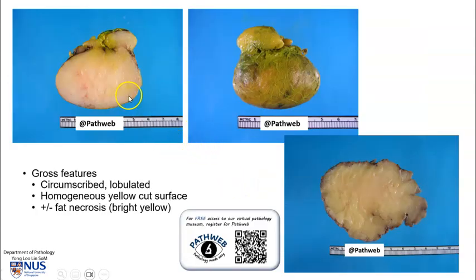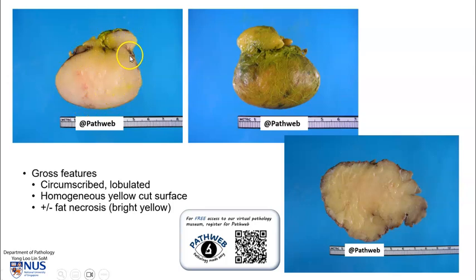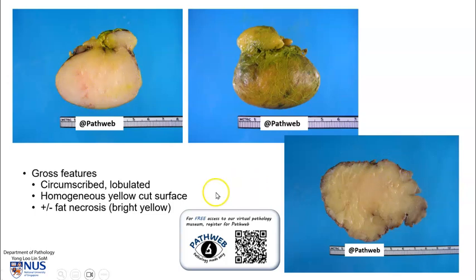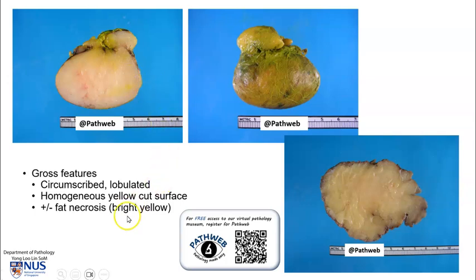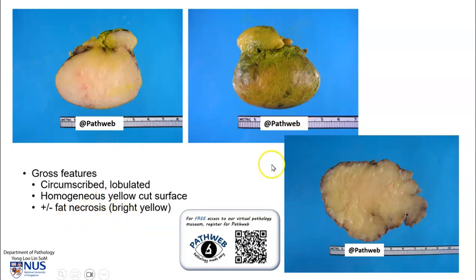Grossly, lipomas are usually well-circumscribed, and you can see here that they have this lobulated or nodular gross appearance. The cut surface is usually homogenous and yellowish. Sometimes, in larger tumours, there may be bright yellow areas of fat necrosis, and we do not see this here.